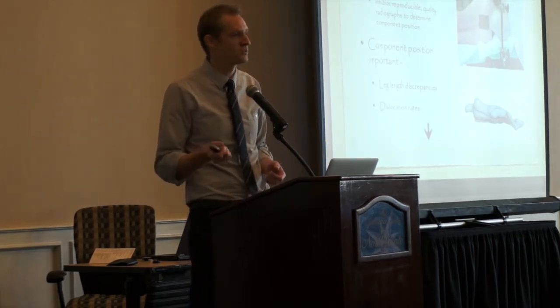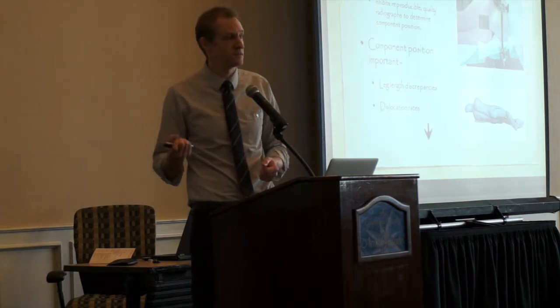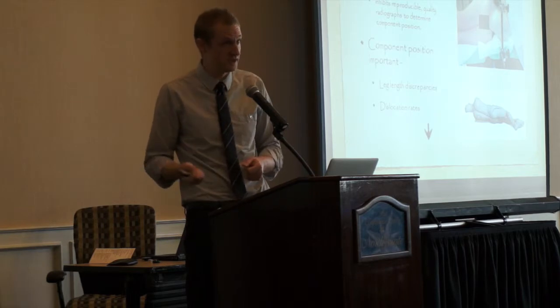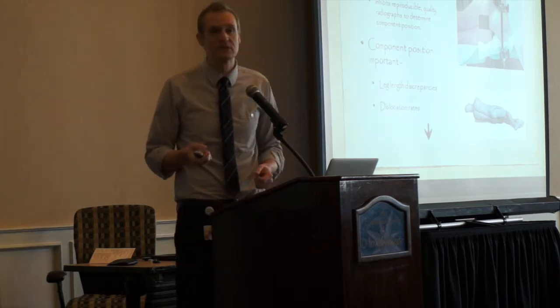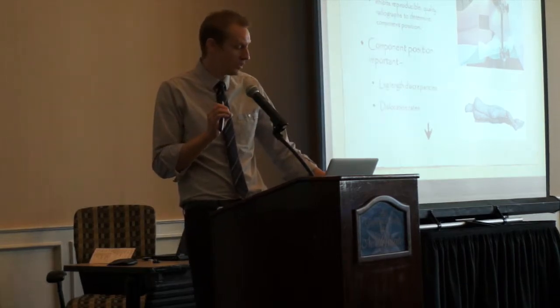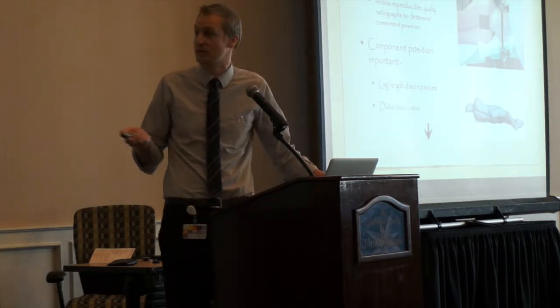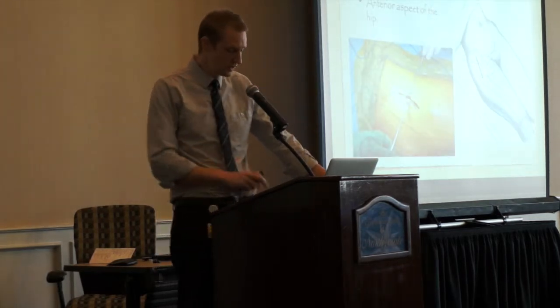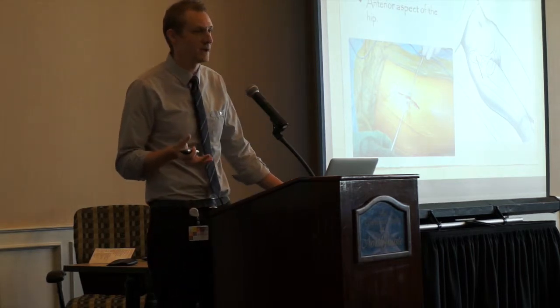And you can kind of wish, oh, I wish I had 5 degrees this way, 5 degrees that way, but you're not going to take the patient back for 5 degrees here, 5 degrees there. It just is what it is. Component position is important because this is one of the direct causes of leg length discrepancies, as well as lowering dislocation rates. So switching gears to the anterior approach, the patient is positioned flat on their back.